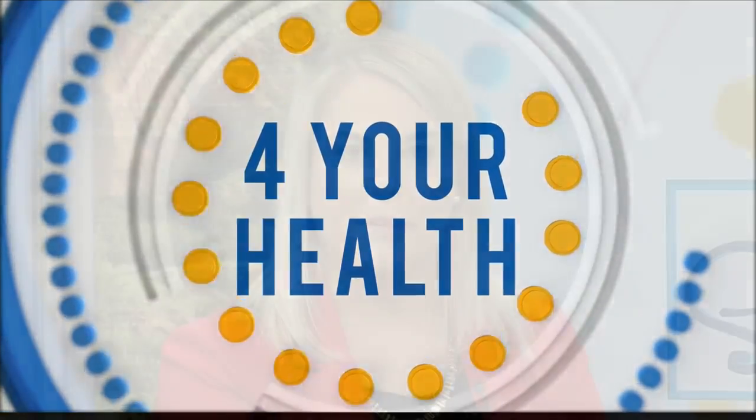When it comes to breast implants, there are several options: saline, silicone, and textured implants. Recently, there's been a recall of certain implants because of the potential cause of anaplastic large cell lymphoma. Another potential issue is breast implant illness. So what does all of this mean, and what should you do if you have implants?